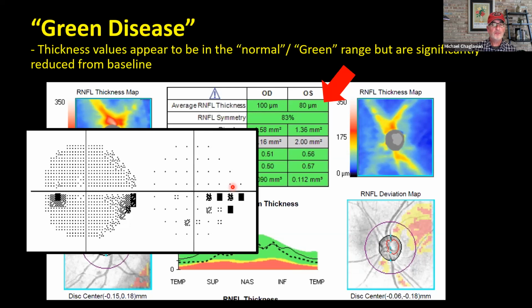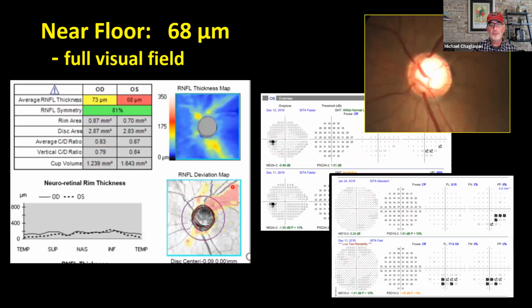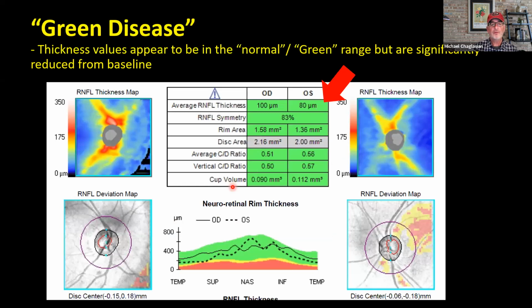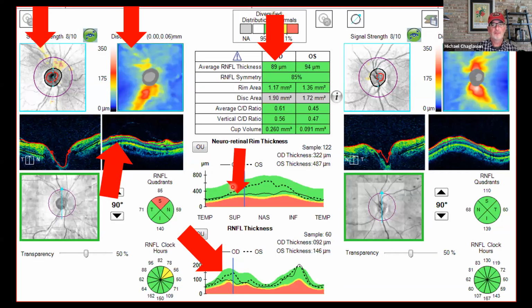And some of these patients, when they're good test takers, will show you early disease on visual field. And as I just showed you, 10-2 or some of the other new options from Zeiss, including the 24-2C that has extra central points, is another option. But any test of threshold visual field is satisfactory. You don't have to have just Zeiss. Sorry, Zeiss people.